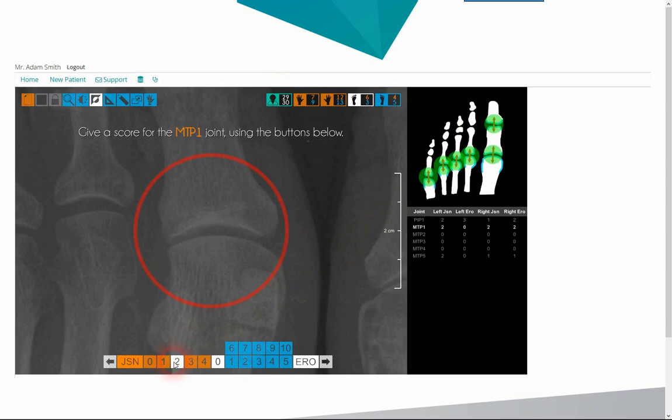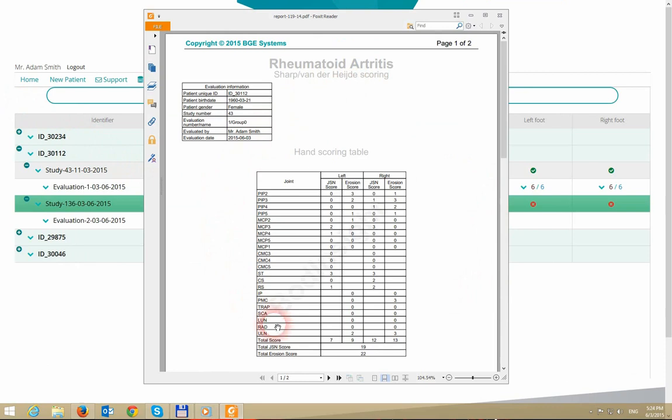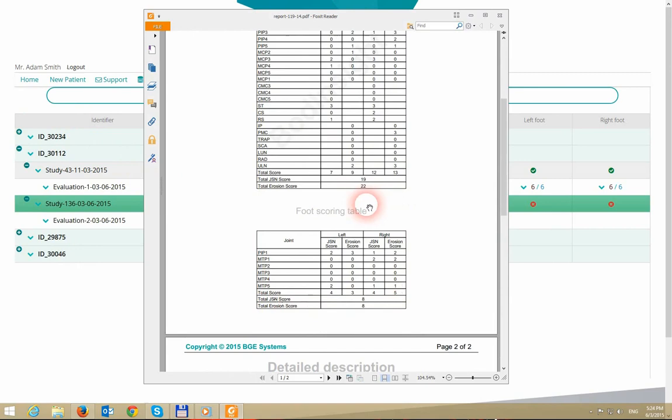A summary report can be printed to a PDF. This report contains the detailed and summarized scores for every inspected limb, making the diagnostic process easier.